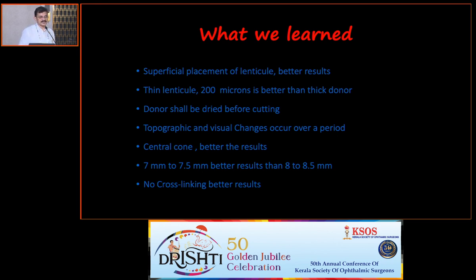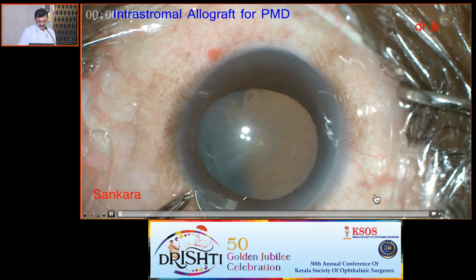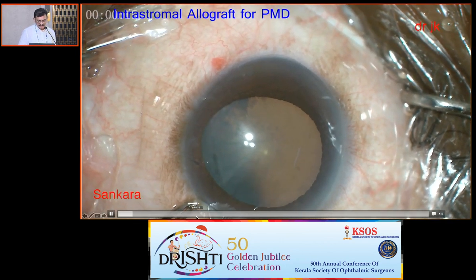When we did a smaller one, with 7 lenticules, only the smallest size is used, they are much better. We want to retry. Then comes the next condition, PMD, where you can see here a very nice thing: this also can be done.